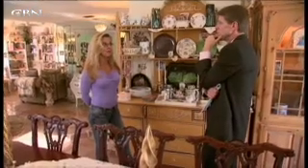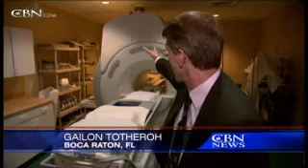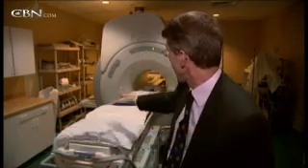3 years later, Wendy decided to go with ultrasound. This is where it all happens. In conjunction with the images from a standard MRI machine, the patient lies down, her abdomen is there, and the ultrasound beams come up from there and do the surgery. Dr. Joy Polifrone describes how those beams work.